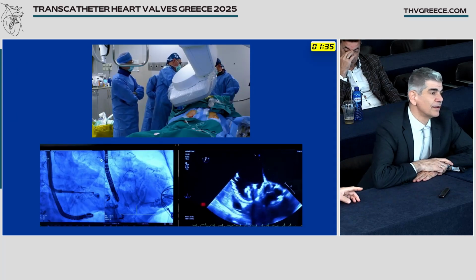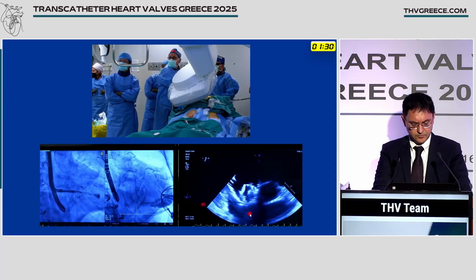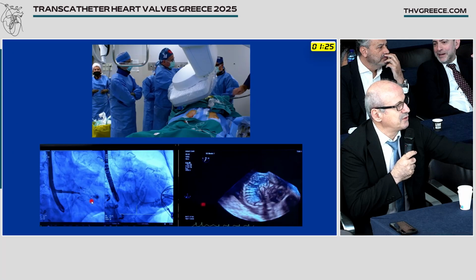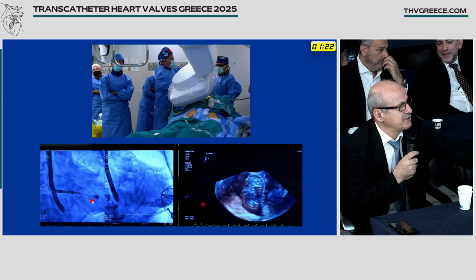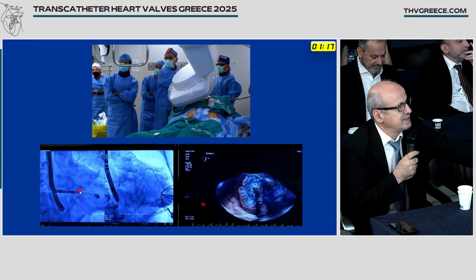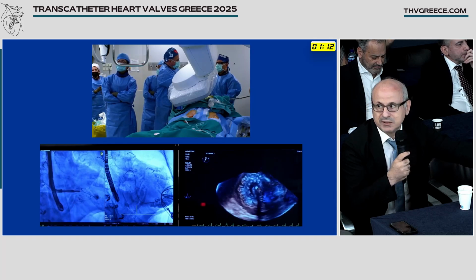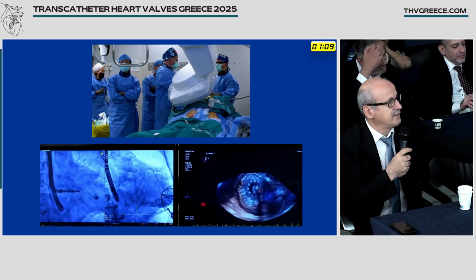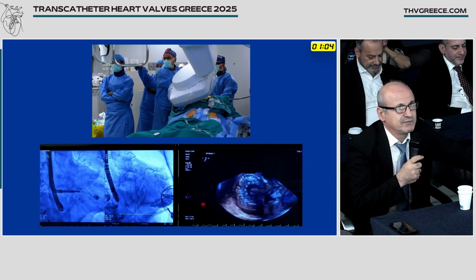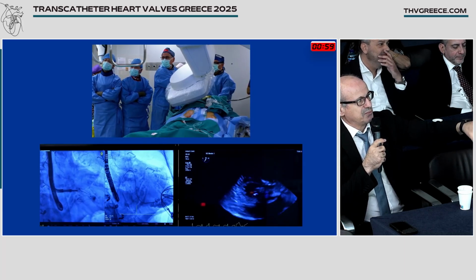These are those nitinols. Michalis, can I have this? You see the valve is still connected to our system, although it's released. So the flange is open, the valve is open, the hook through the fabric is on the septum, but you see we're still connected to our delivery system with these multiple nitinol wires. These were the tedious part that these guys were doing in crimping the valve. And now this is the final release of the valve when you release those multiple nitinol hooks, and now the valve is completely free.